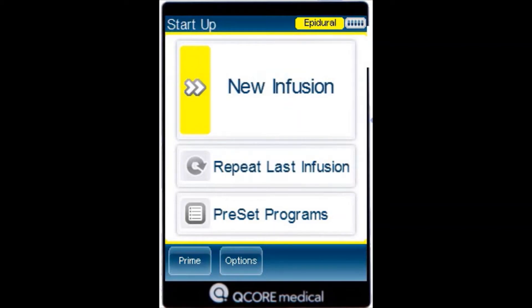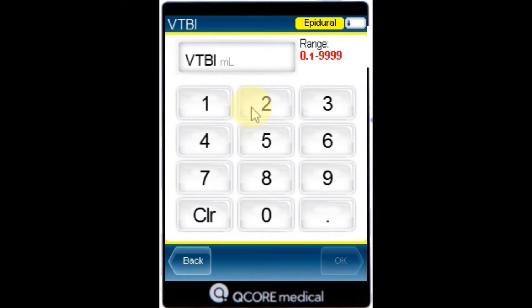Verify the pump is in the epidural intermittent mode. From the Startup screen, select New Infusion. Using the keypad, enter the VTBI value, then press OK.